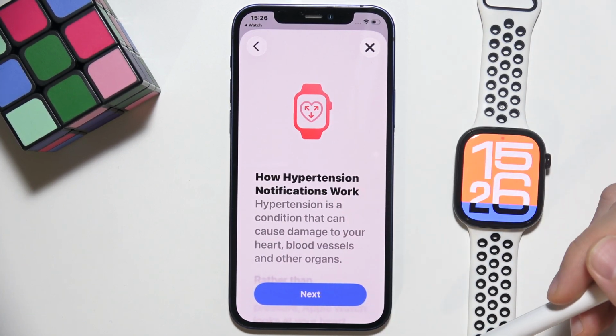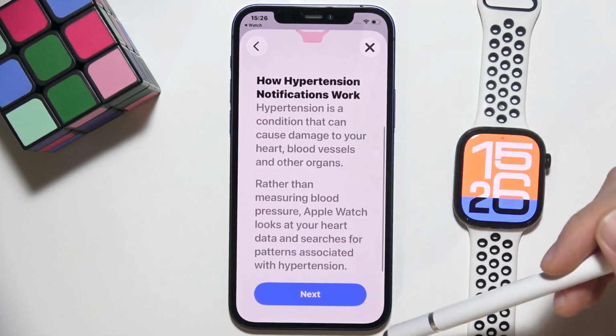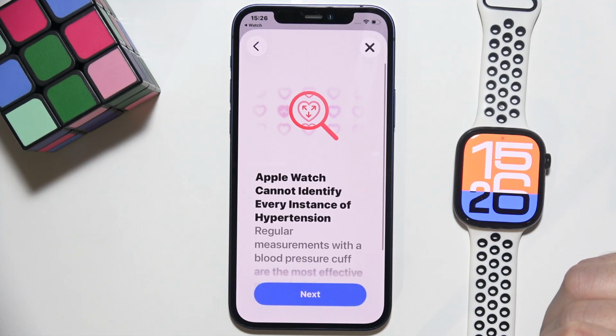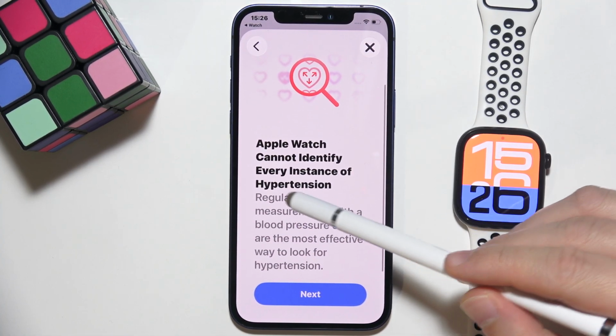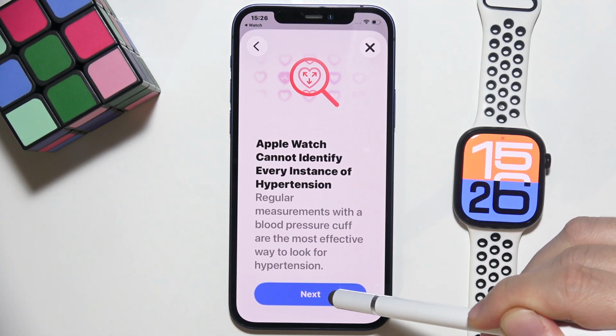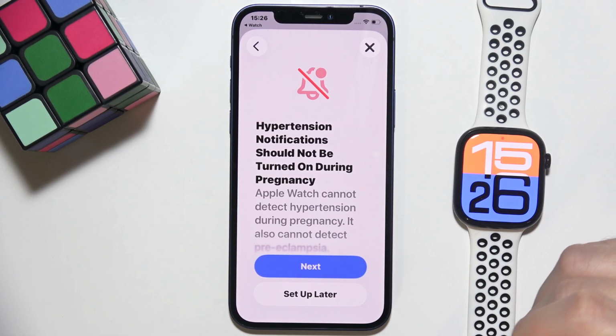Now there's short information on how it actually works. So I can recommend you to read this short information. Click next. As you can see, we get information that Apple Watch cannot identify every instance of hypertension, which is really useful information. And here we can find that the hypertension notification should not be turned on during pregnancy.